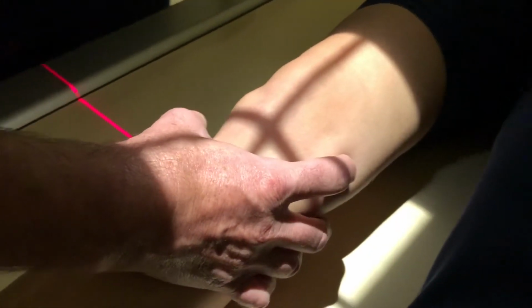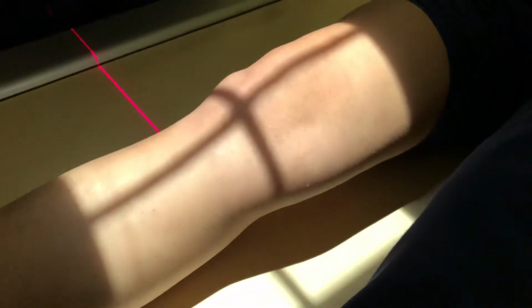Next we're going to do is a lateral oblique or external oblique. Same thing, it's going to be a 45-degree rotation. Still going to center a 1/2 inch below the apex of the patella. And on this view, we basically see everything that's on the medial side. So the condyle of the tibia, and condyle of the femur, and epicondyle of the femur.